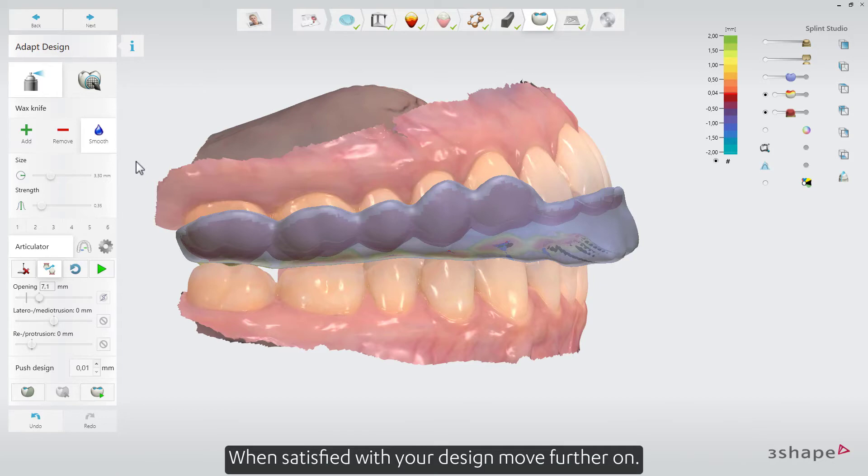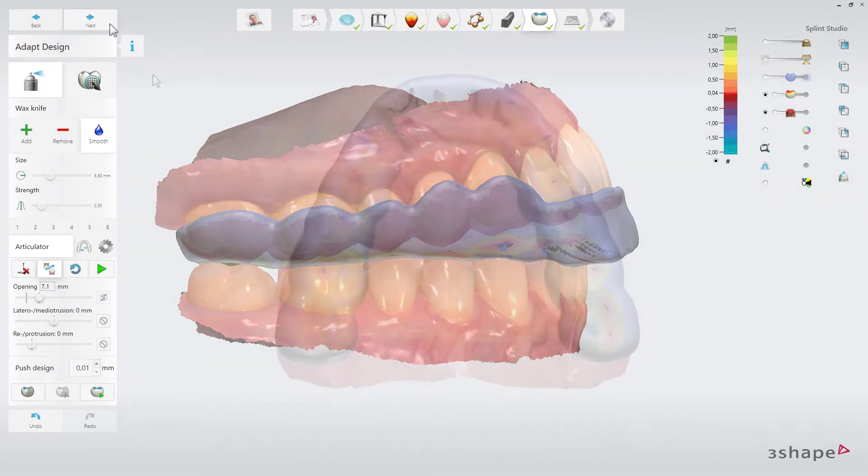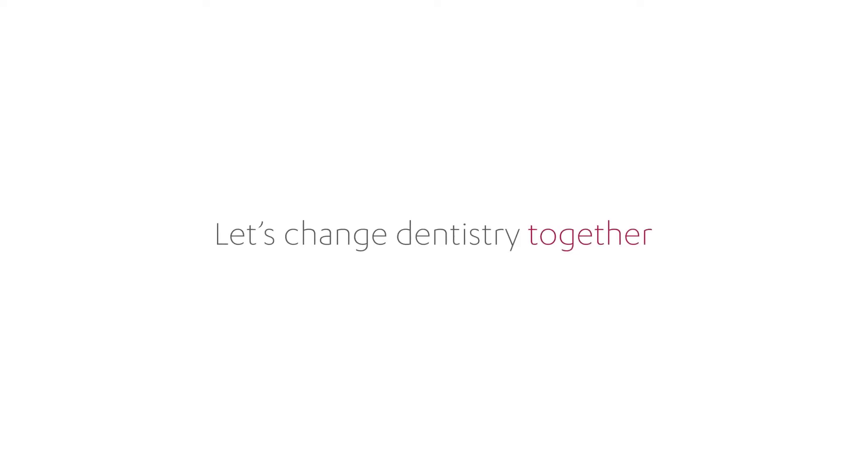When satisfied with your design, move further on.